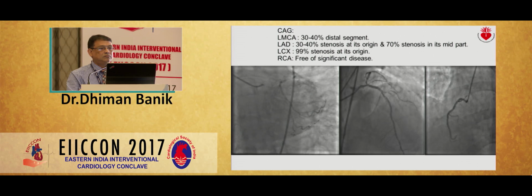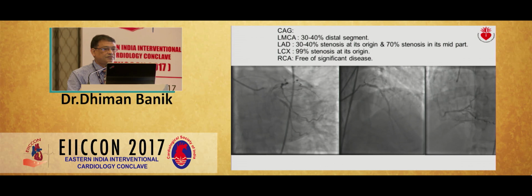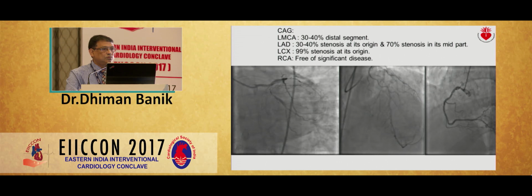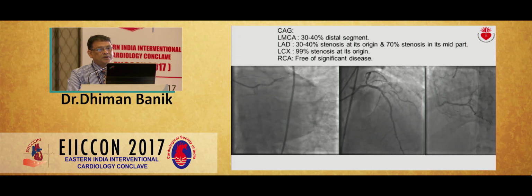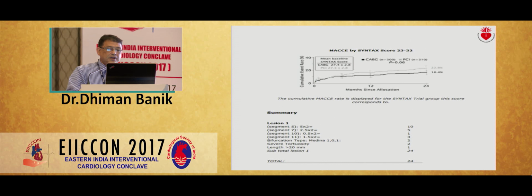As this is a live in box case, I want to have some opinions for this case. I have calculated the SYNTAX score of this patient. His SYNTAX score is 24. So I want some opinion for this patient, and next I will show what I did for this patient.